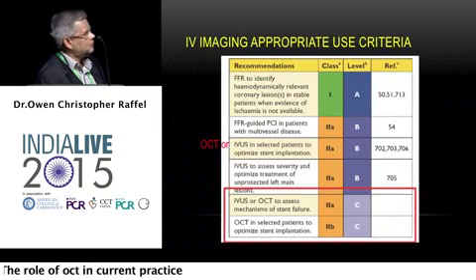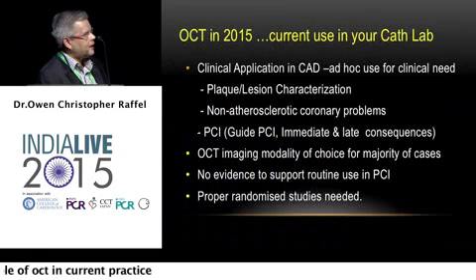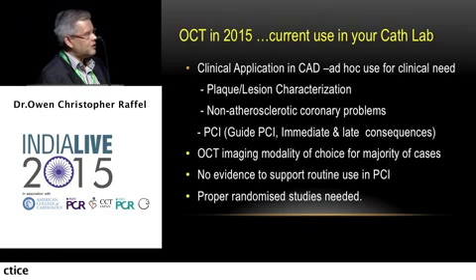And to conclude, I think it is clearly the investigation modality of choice for ad hoc clinical use in all of these areas. There's no evidence to support its routine use in PCI, and that includes OCT or IVUS. And clearly, hopefully, we will get some proper randomized studies for the first time in intravascular imaging to actually sort this problem out. Thank you.